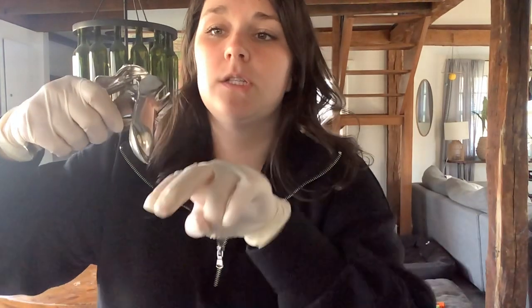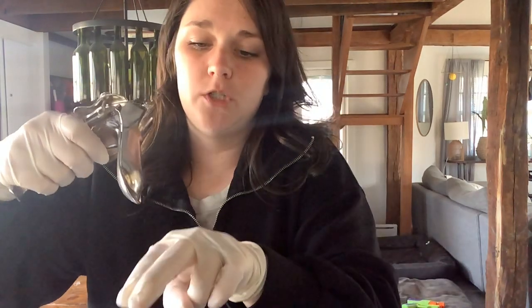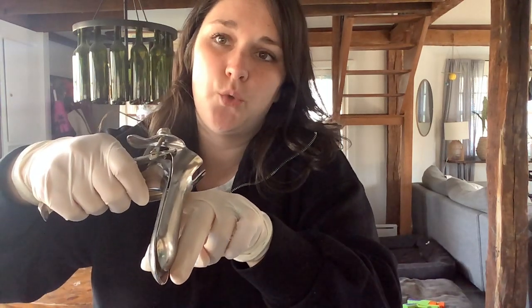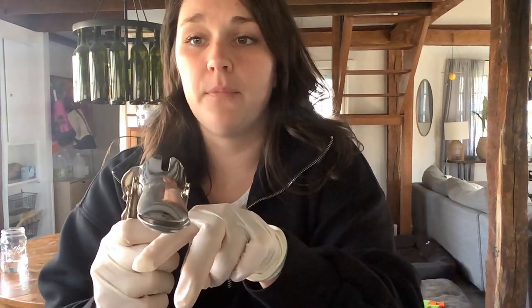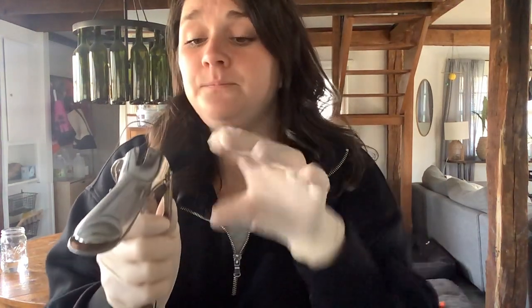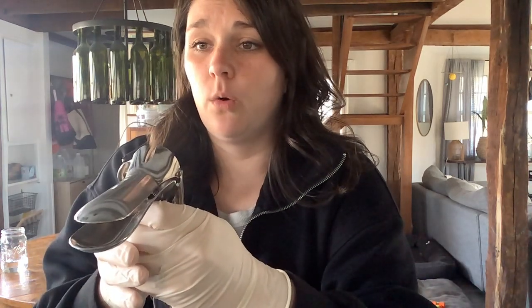You take your fingers on the posterior part of her vagina. And I'm going to gently push down. When I'm gently pushing down, I'm entering this into the vagina like this, and then I'm gently turning it at the same time. You want to make sure that this remains closed until you are into the vagina. When I'm into the vagina, I'm going to gently open this.